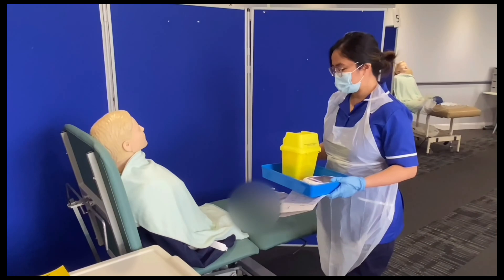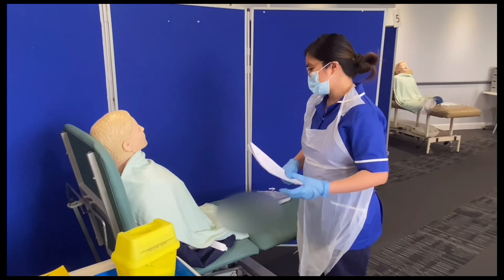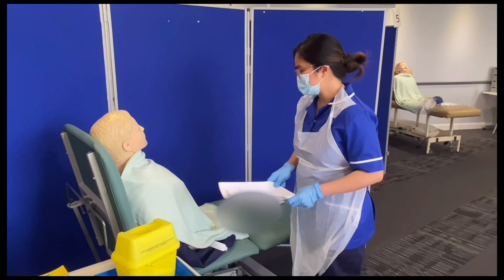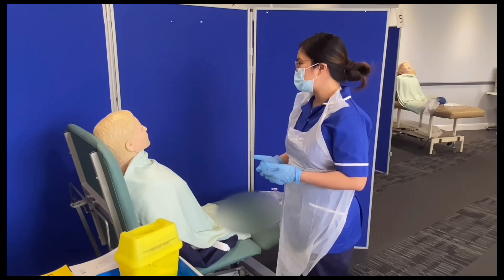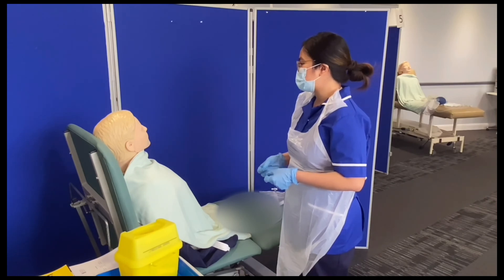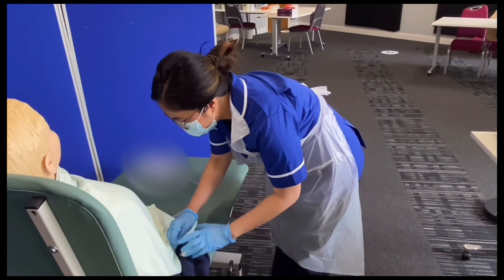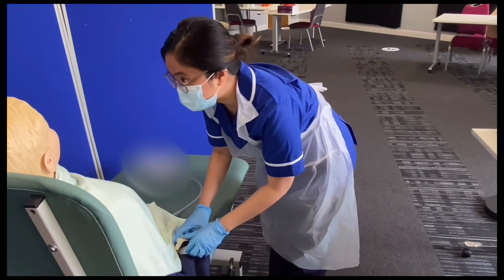Hello Jennifer, I'm back. I'm just going to put this equipment here. I'm going to do the blood sugar check now for 2 o'clock if that's okay with you — are you happy for me to proceed? Yes, you can. Can I ask which side did you have it done — right or left hand? On my left hand. Right, so we'll do it in your right hand now. I'll ensure that I don't use the thumb and index finger, and I'll do the prick on the side of the fingertips. I can see that your hand is visibly clean; otherwise if it were dirty I would use a clinell wipe to clean it.